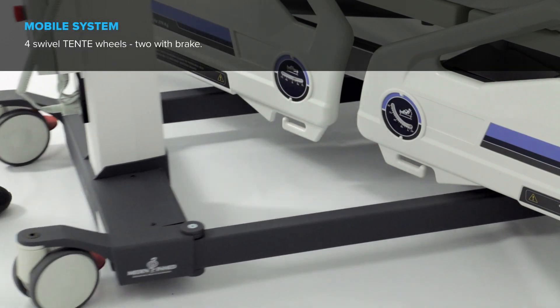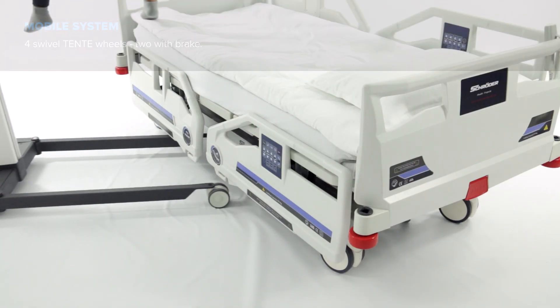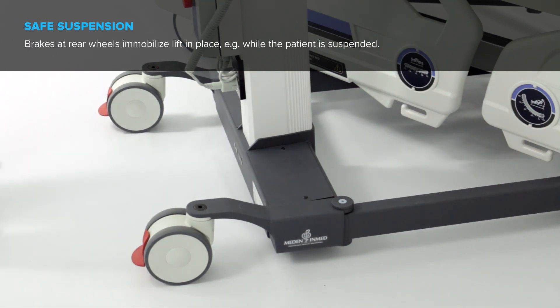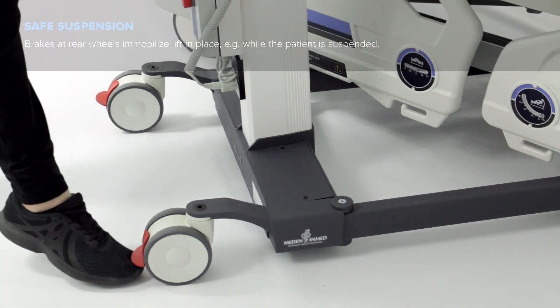Four swivel TENTE wheels, two with brake. Brakes at the rear wheels immobilize the lift in place — for example, while the patient is suspended.